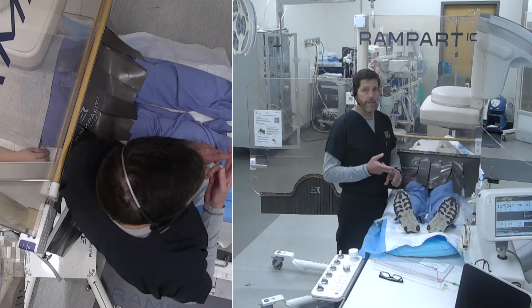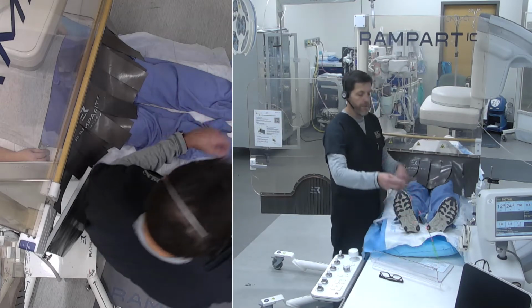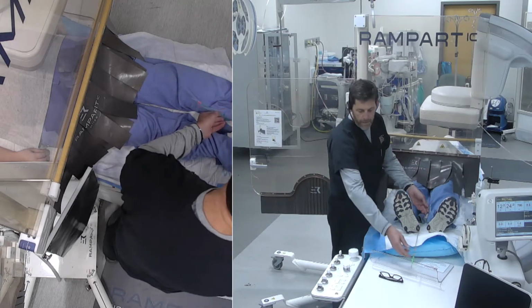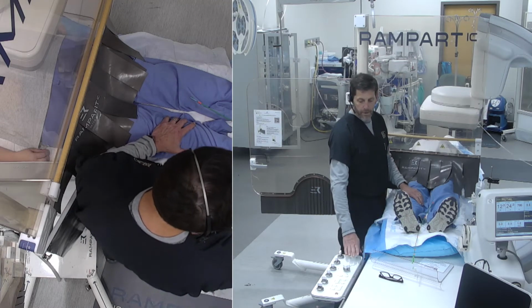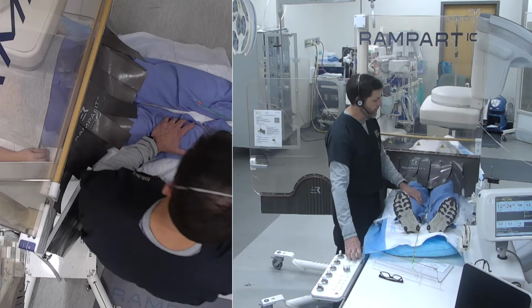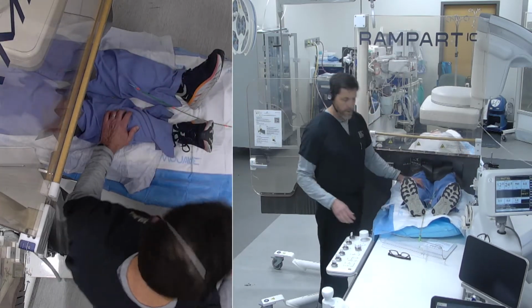The only two things that, again, I would remind you is, number one, use a slightly longer sheath when you're going up and over, usually 65 centimeter, to be able to go up and over. And then when you're doing pedal cases, if you run your own table, make sure that your controls are at the right or below the foot level, so you can advance this easily and don't have to step back and feel like you're reaching.